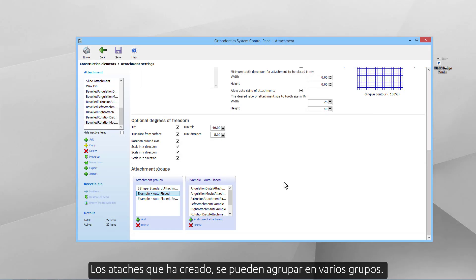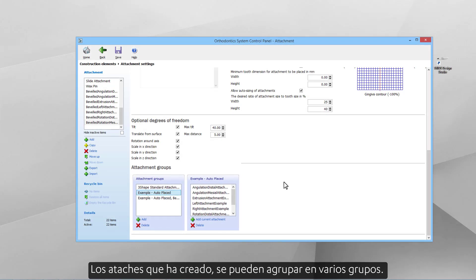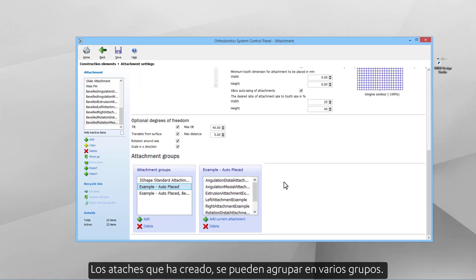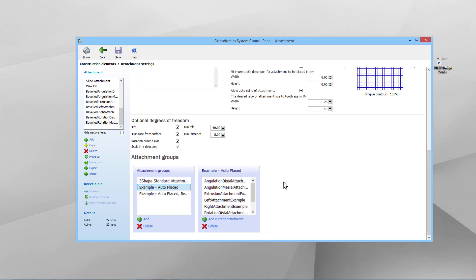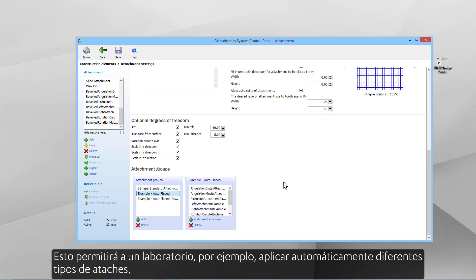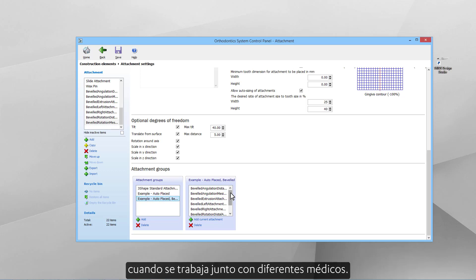The attachments you have now created can be bundled into various groups. This will allow our lab, for instance, to auto-apply different types of attachments when working together with different doctors.